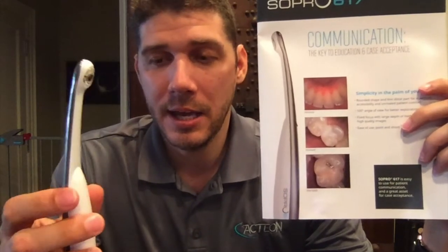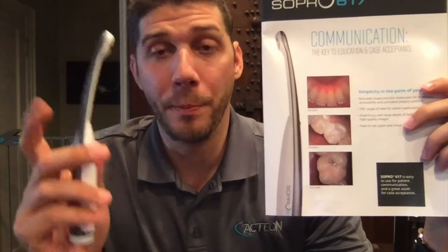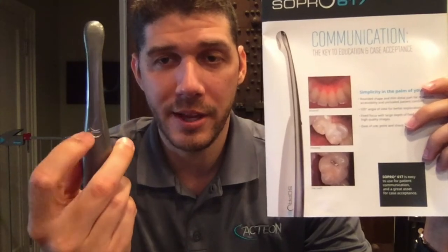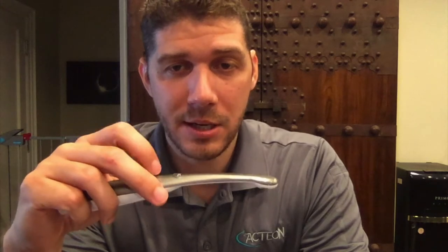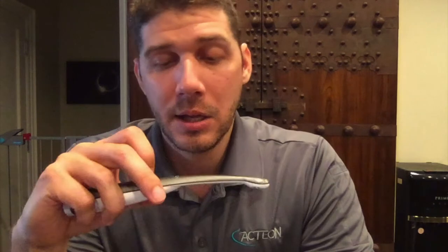This is a really easy to use camera. The only button on this camera is right here, and all of our cameras feature what is known as SOPRO Touch. Some cameras have an actual physical button, but you'll notice the difference — when you push a button, the head of the camera moves, and that movement translates into a blurry image.